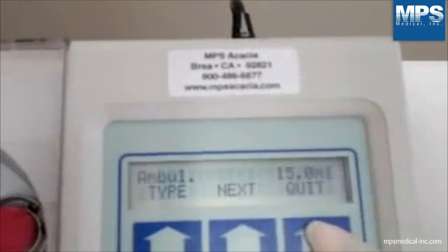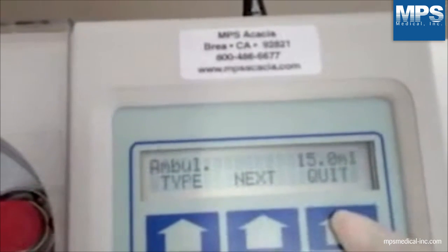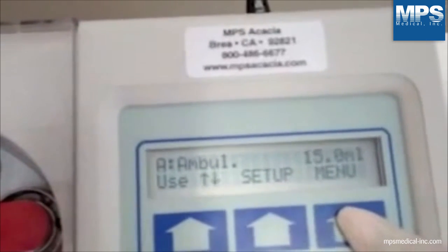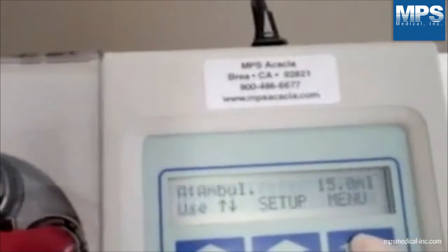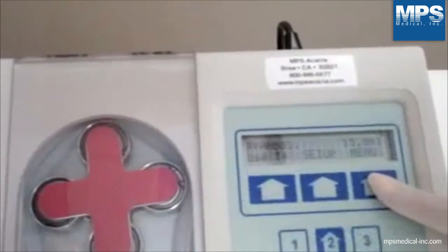Whenever quit appears on the screen, you may press the function key beneath it and return to the main menu. A foot switch may be used in lieu of the start and stop button for dispensing, by plugging into the round receptacle located at the rear of the pump.